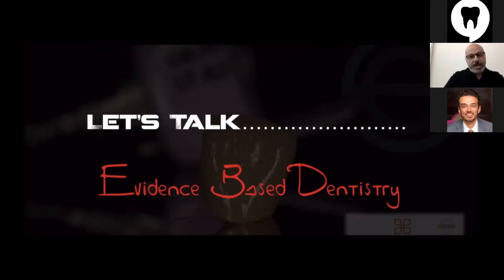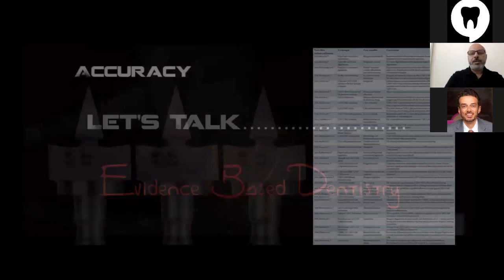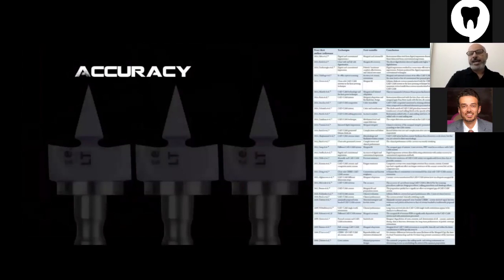Let's talk some evidence-based dentistry at the beginning. Of course, accuracy is the most important thing about restorations, and lots of dentists were fearing the difference in accuracy, specifically in marginal adaptation, between the analog way, for example pressable ceramics, compared with CAD-CAM.